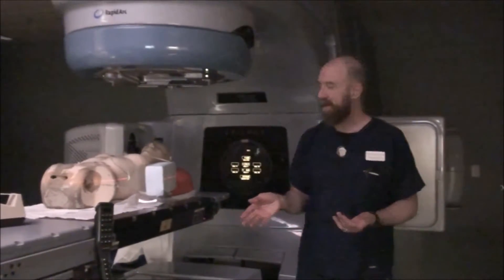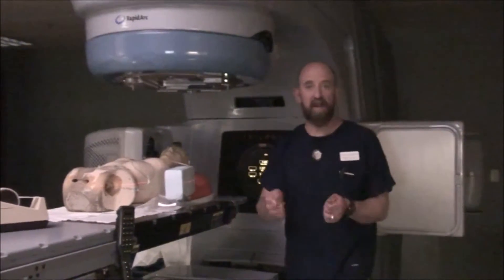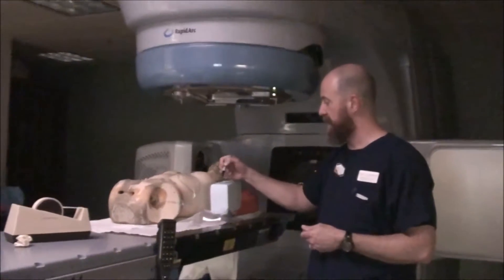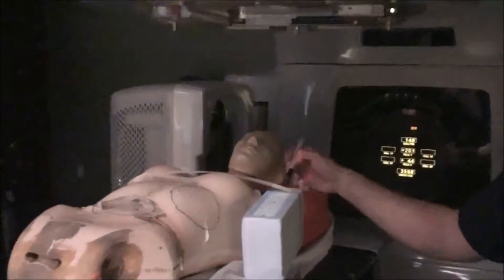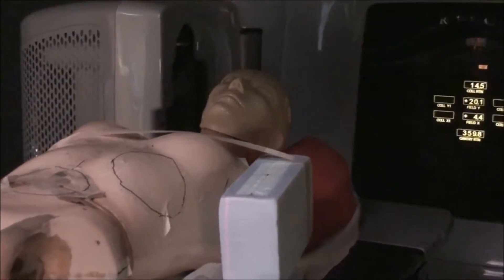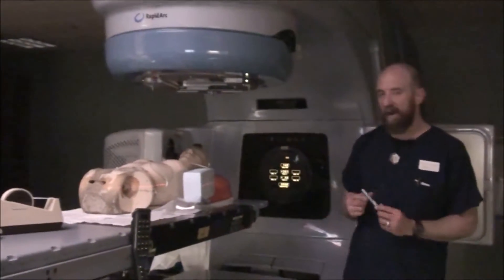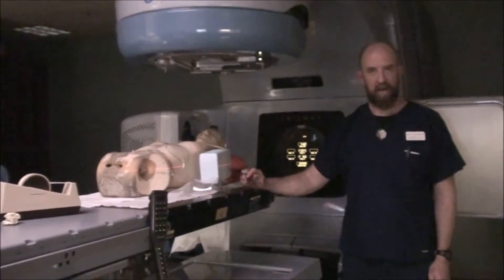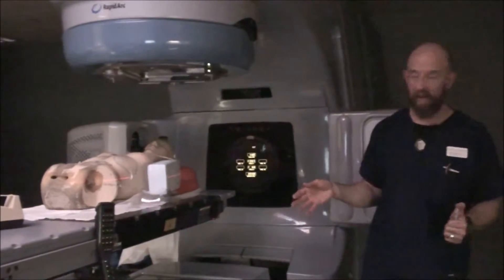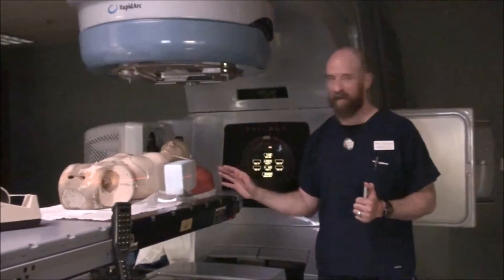Go get that x-ray approved before you do anything else — the doctor may change their mind. Once the doctor approves it, you can mark the superior and inferior borders. I like to do that on an extremity as well, because you're often going to be doing a three-point inline setup. That means the therapists are going to position the arm along the axis of the CR, using the CR and inferior marks to get lined up. I usually don't mark the lateral mark for the humerus because it's just not really reliable — the therapists are probably going to ignore it.